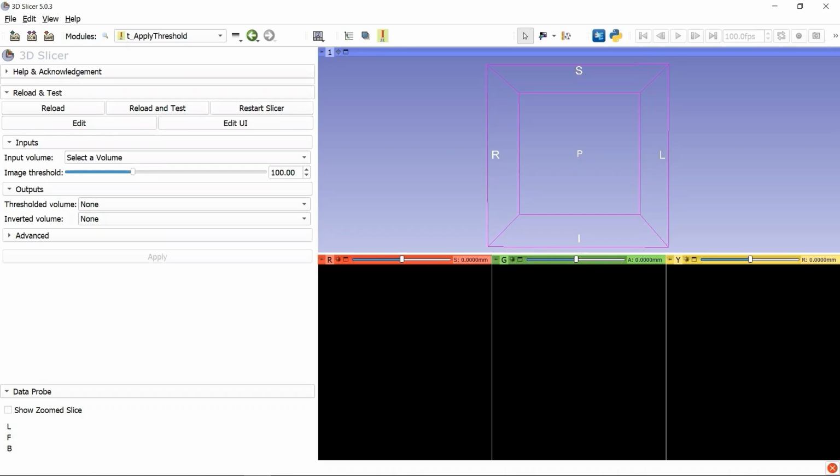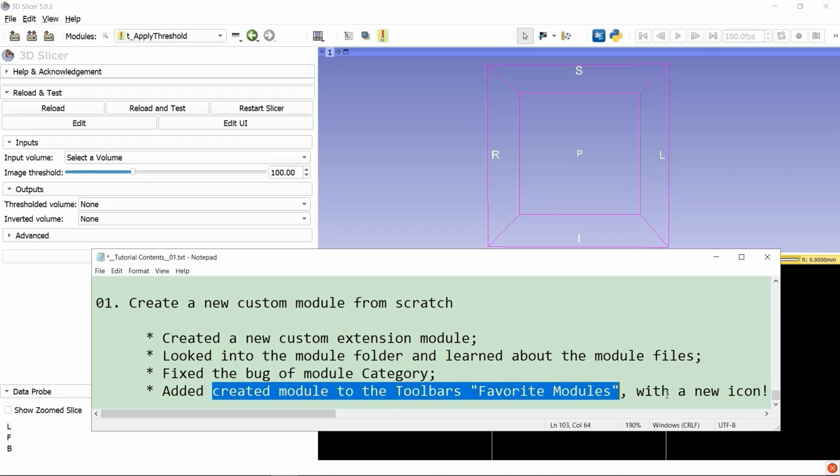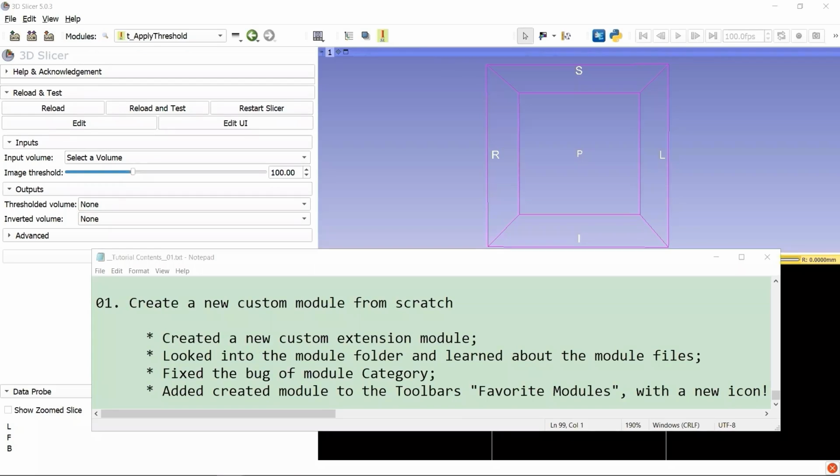Let's make a summary for this video. In this tutorial, we created a new custom extension module, looked into the module folder, and learned about the module file. We fixed the bug of the module category, and added our newly created module to the toolbar favorite modules with a beautiful icon. That's it.